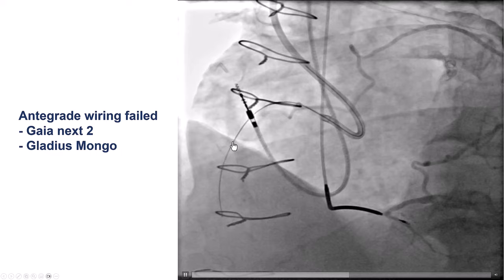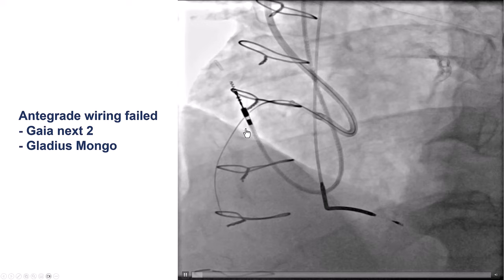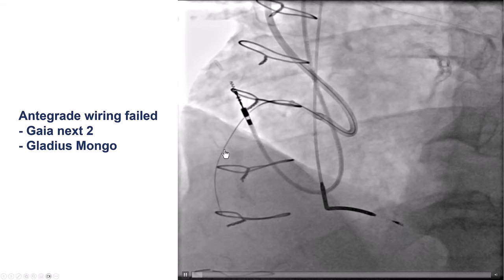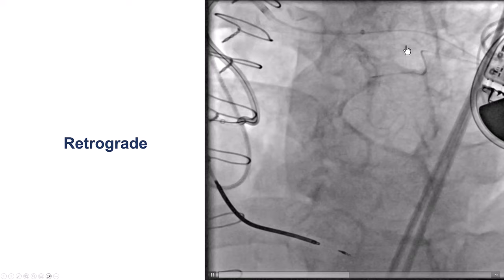The wire is not in the vessel architecture, so after multiple attempts, we decided to switch approach. In this particular injection, we can see a little better the anatomy — there is actually some patent lumen in the middle right coronary artery. So we went retrograde.